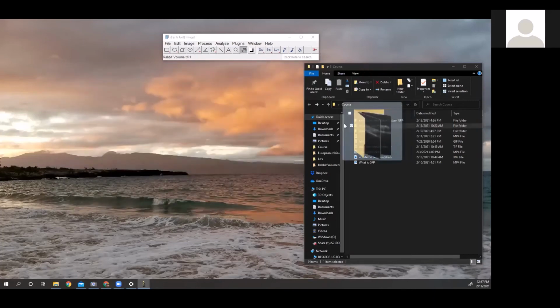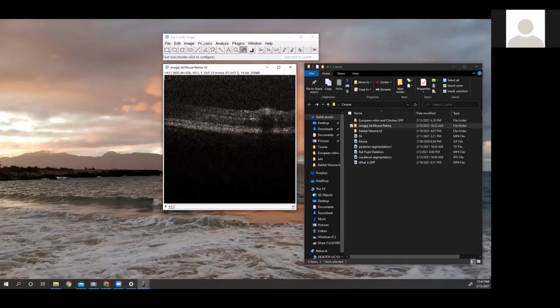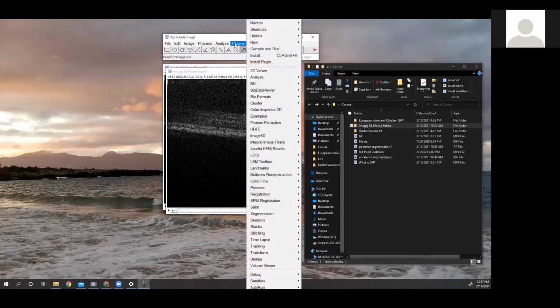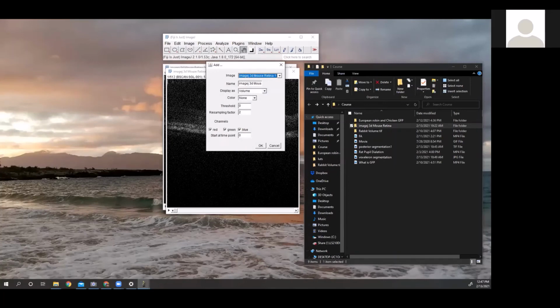But if I do, say, this one, which I've gotten very good results with this set, I will change this into here. Yeah, my stack. Give that just a moment. Now this will take a little bit longer. As you can see, it's trying to duplicate the 512 different images to allow me to do a 3D on here, and I will just simply open that up.